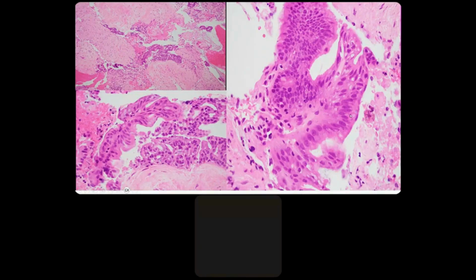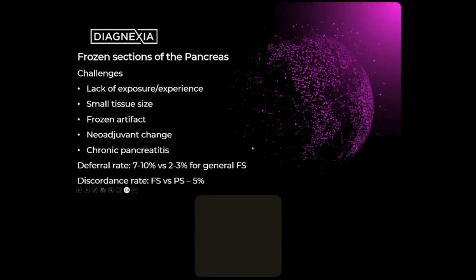And this happened to be from an intraductal papillary mucinous neoplasm. And here you can say what the diagnosis is. You've confirmed that because you know it's a cystic lesion on the radiology, and on the material that you've got, it is low grade. And then you caveat that by saying other areas may show worse features.